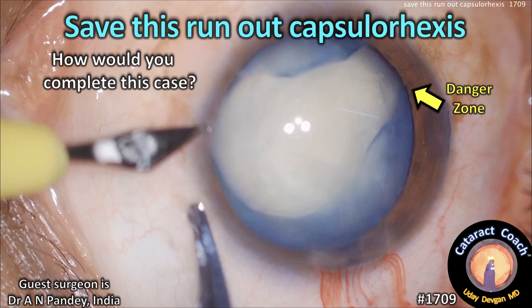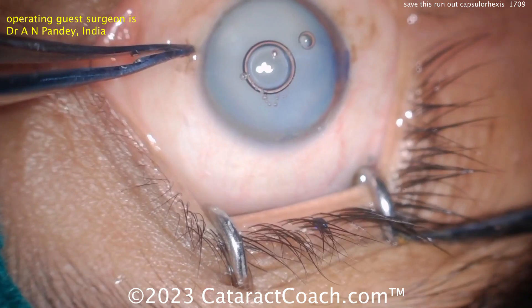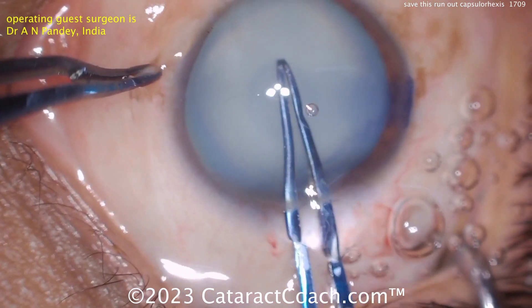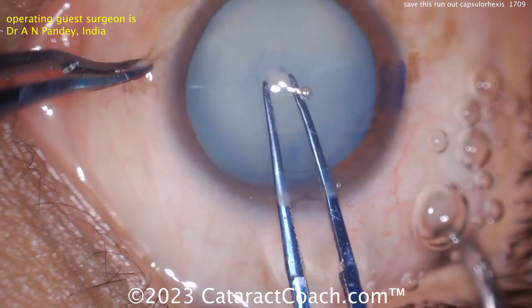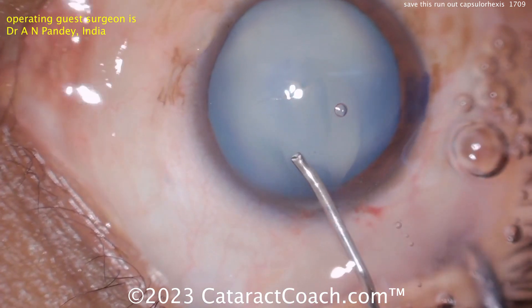cataractcoach.com — save this run-out capsulorexis tough case here: intumescent white cataract. Let's watch the video. Starting off, trypan blue dye was used to stain the capsule, and starting off with the double rexis technique.